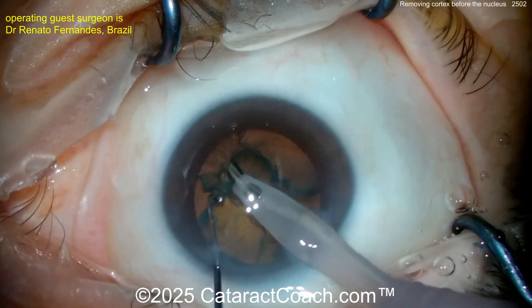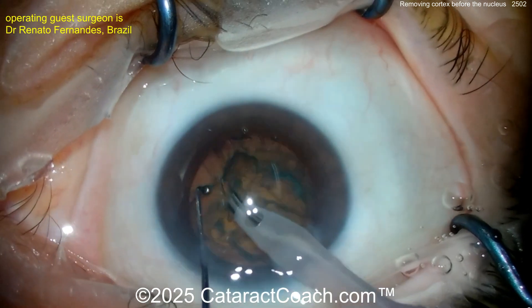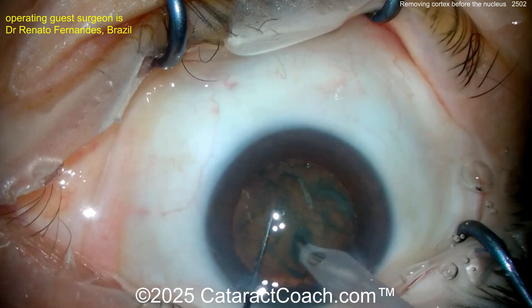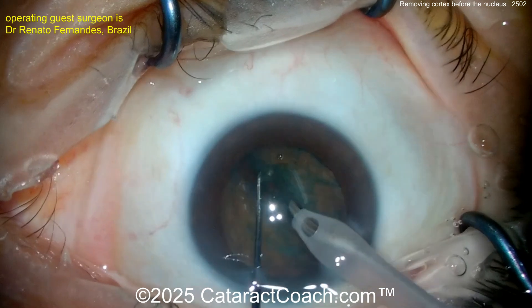The question is: is this going to strip it all the way back, or just to the equator, or maybe just around the equator? Maybe that's enough. If you strip the cortex up around the equator, you won't have anything left. We'll find out. Here comes a nice chop down the middle, beautifully done.